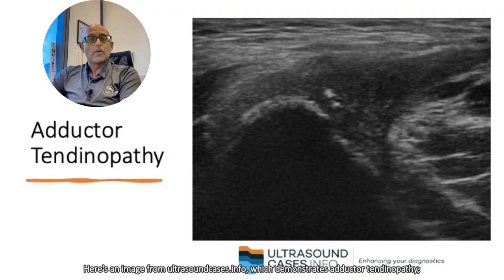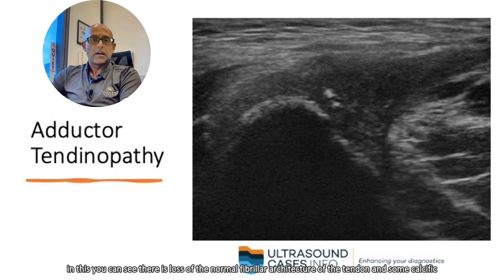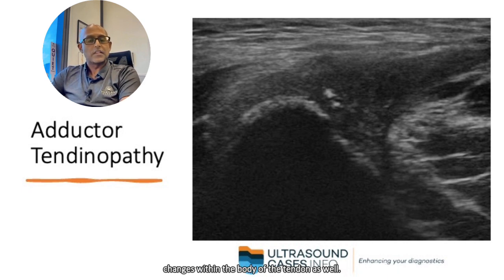Here's an image from ultrasoundcases.info which demonstrates adductor tendinopathy. In this, you can see there's loss of the normal fibrillar architecture of the tendon and some calcific changes within the body of the tendon as well.